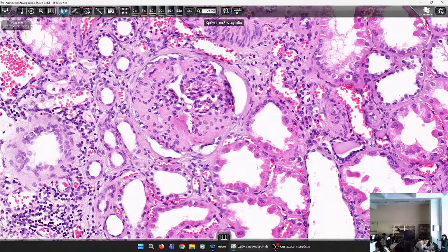So they do not send enough blood to the urinary tubules, which thus become atrophic. That's why I told you all parts of the nephron cooperate with each other. Here we had a disease that started in the tubulointerstitial compartment. We had the cells of chronic inflammation, of chronic pyelonephritis. However, they affected the vessels secondarily. The vessels of the interstitium were secondarily affected.